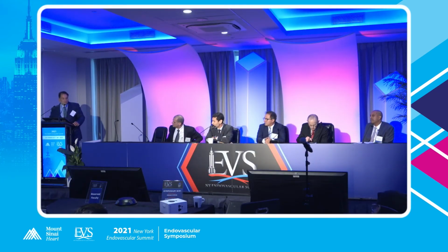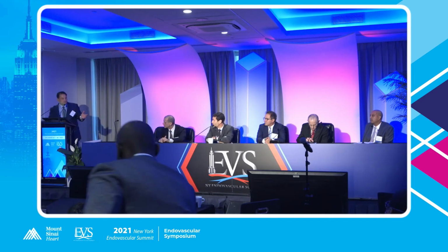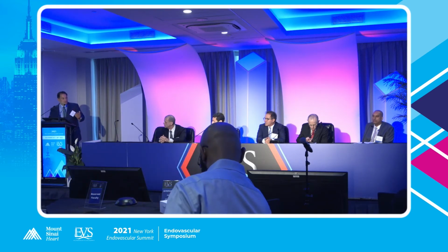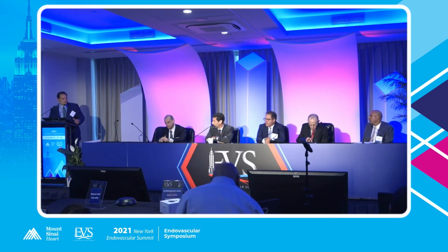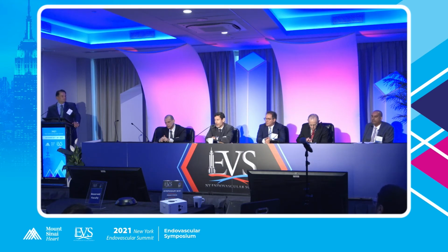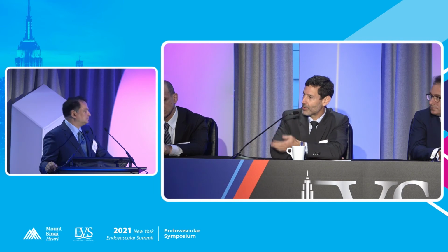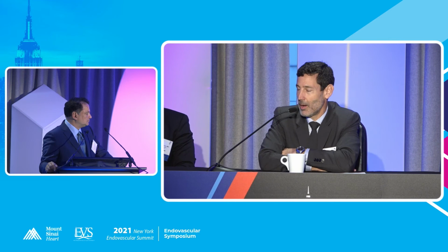Brian, just a question I want to bring up. You did a great overview of that. But how do you assess where the calcium is? I love that end where you put it together, which is really intuitive. But clinically, how are you assessing where the calcium is so you can go down your algorithm? Yeah, so the first thing I'll say is sometimes you could look at it and see this is never going to work with atherectomy, and those are the ones that I go to Supera for. On the other hand, for those lesions that seem like you have a rim of calcium on the outside, but you seem like you have a hollow core, those are ones that I think Shockwave is pretty good for.